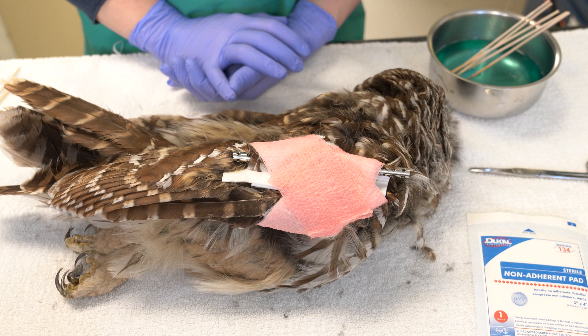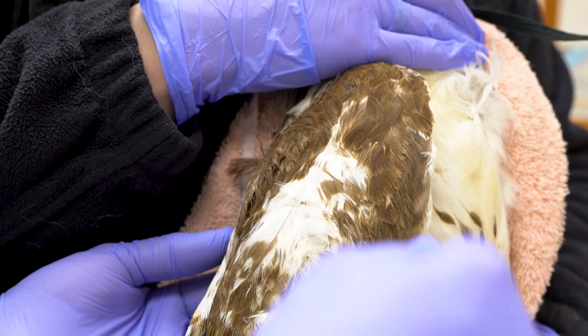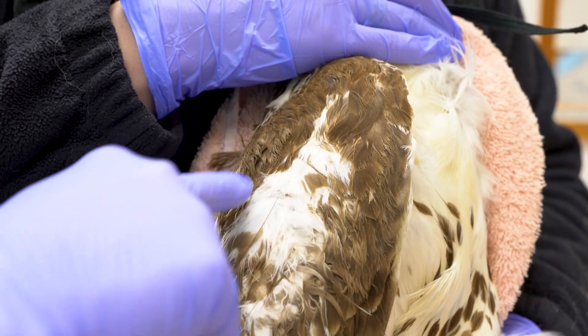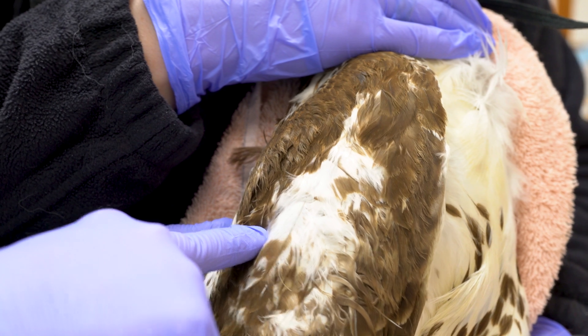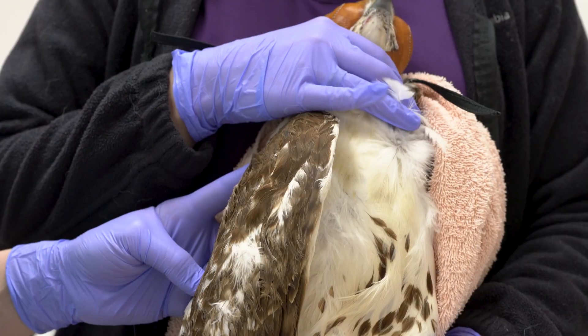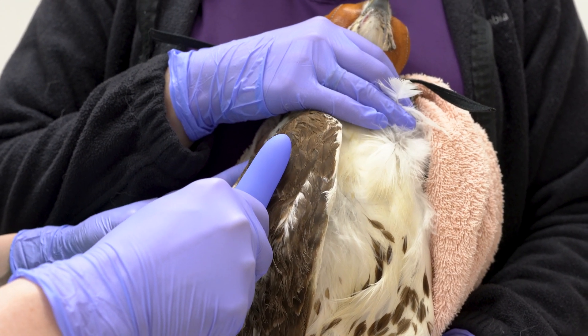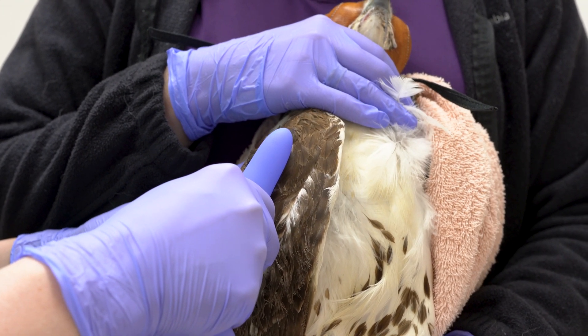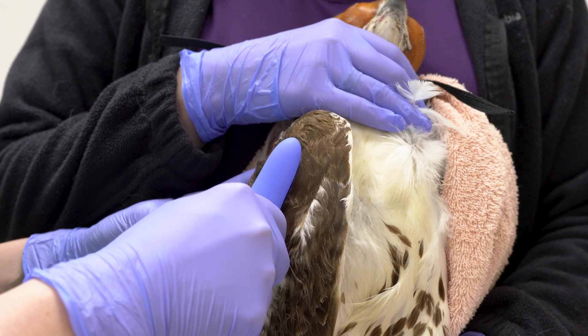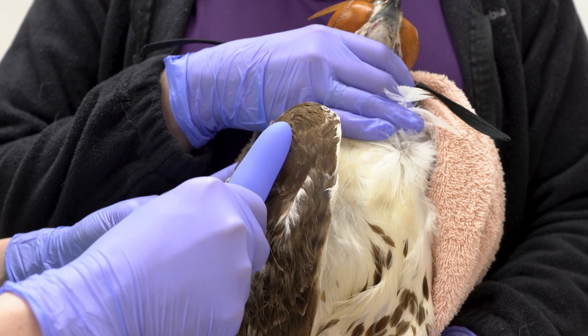Now here we will imagine that this live red-tailed hawk is recovering from an ulna fracture repair. Areas of inflammation and edema may benefit from cryotherapy, which can be performed in smaller avian patients with frozen water in the finger of a glove for three to five minutes applied to the skin. Note that this patient has feathers in place that would not usually be there after a surgery.